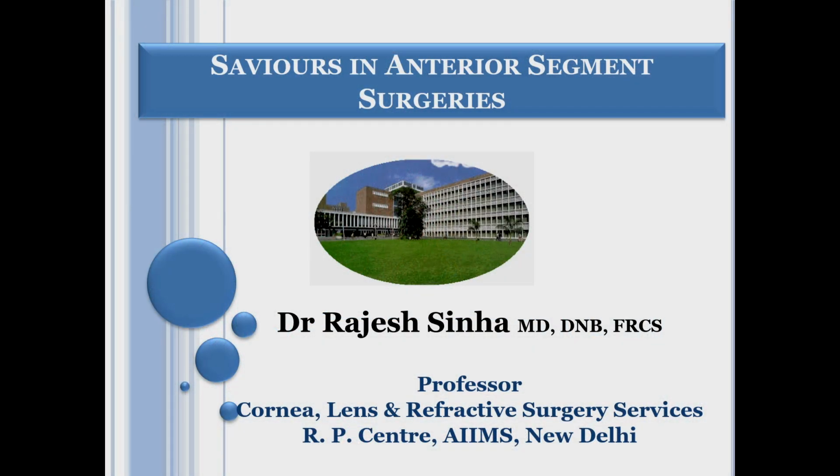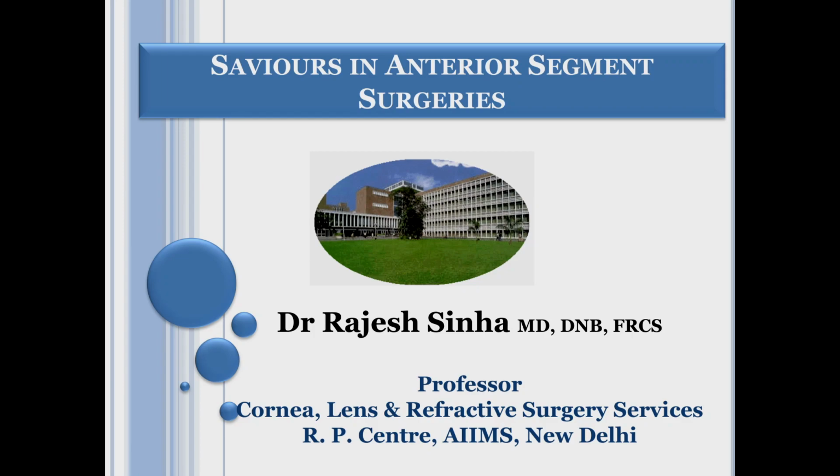The name of this session is Saviours in Anterior Segment Surgery. And the reason why we have labeled it as Saviours in Anterior Segment Surgery is that there are certain scenarios in anterior segment surgeries like cataract wherein you feel that these are troubled situations, wherein you would like to be saved.